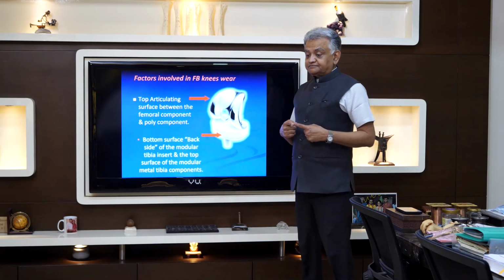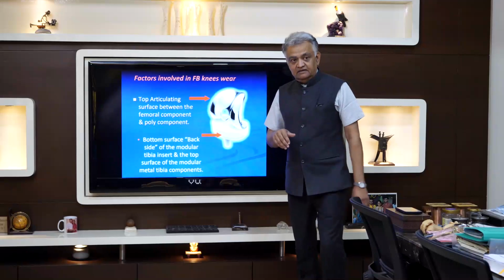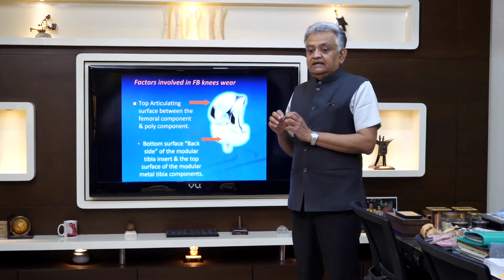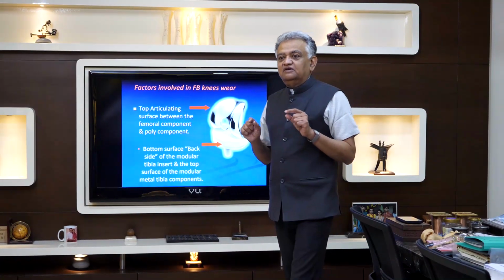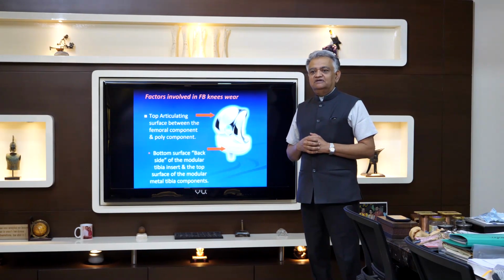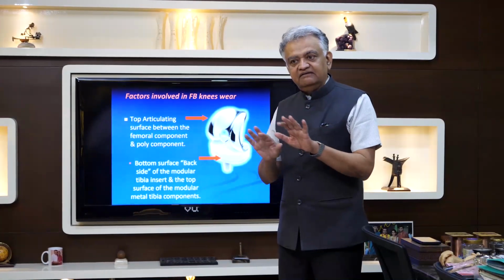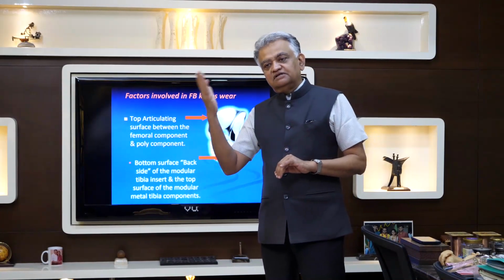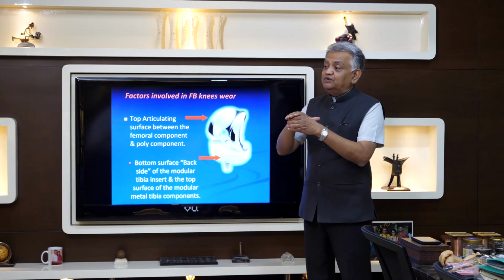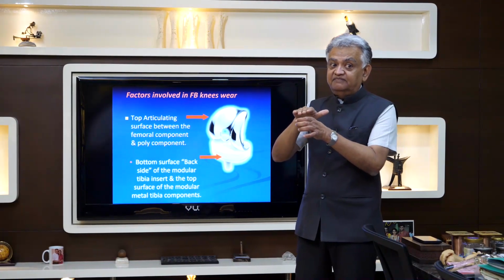If your knee design is modular in nature, which means your plastic can be fitted later as a separate pack instead of being factory fitted, single molded in a monoblock component, your locking mechanism, the way in which the plastic locks with the tibial tray, has become a major aspect of the design evaluation of a knee implant. So many companies, and I will limit it here on this point, we'll talk about it in some other forum, the different types of locking mechanisms which now exist in the market, of how different companies allow their plastic to lock with that metal tray.